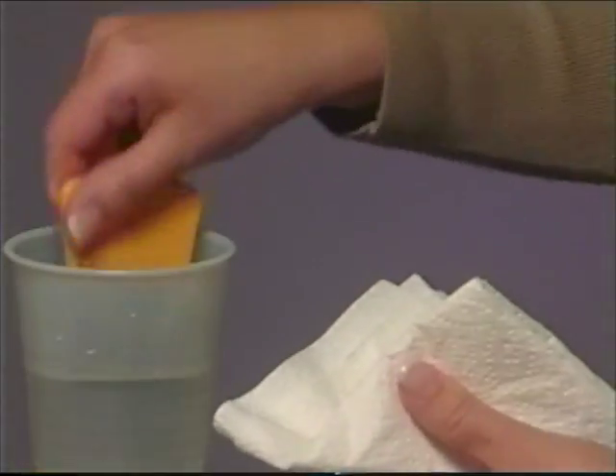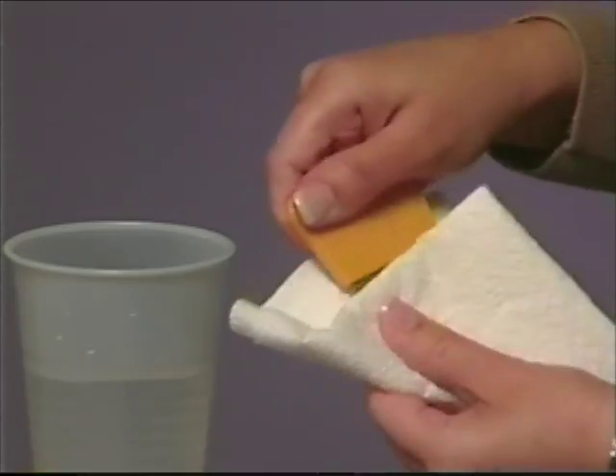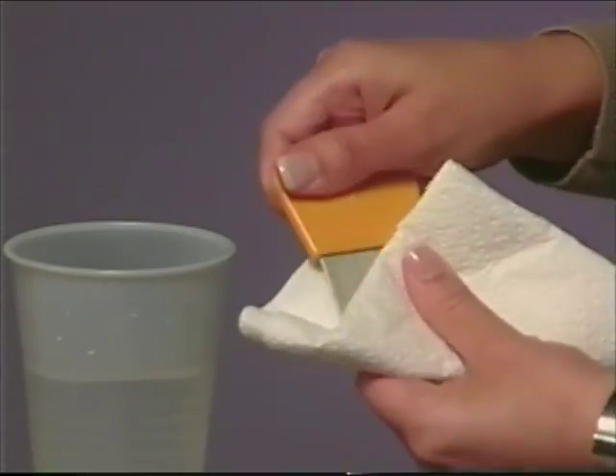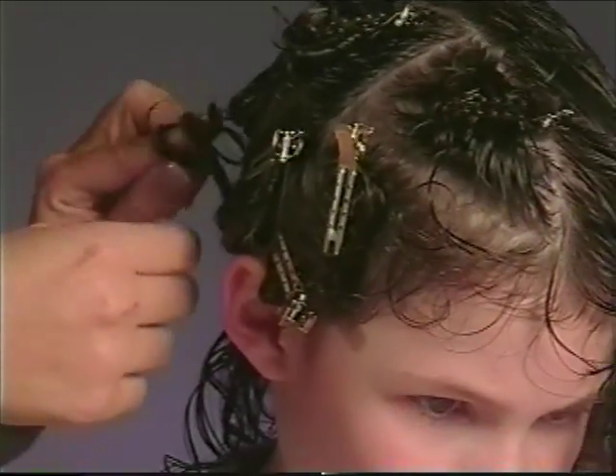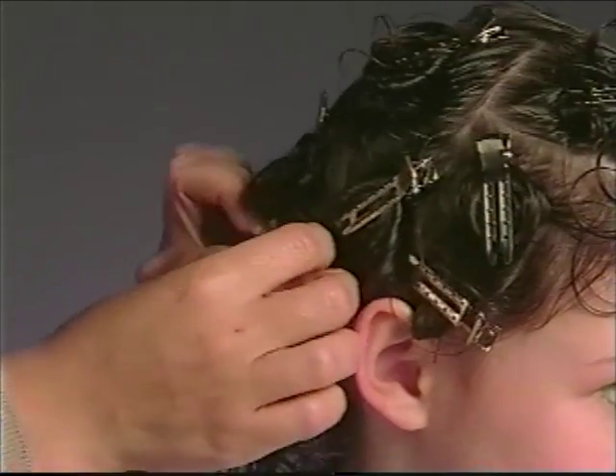It can be helpful to dip the comb in a cup of water between passings, or you can use a paper towel to wipe the comb. Move on to the next section of hair and repeat the process until you've done the entire head.